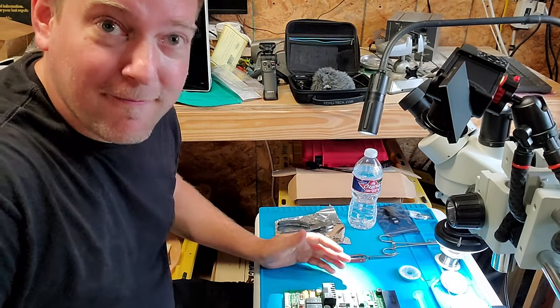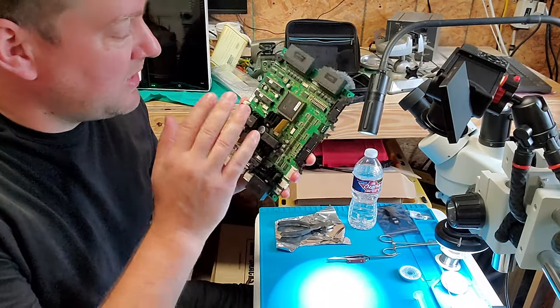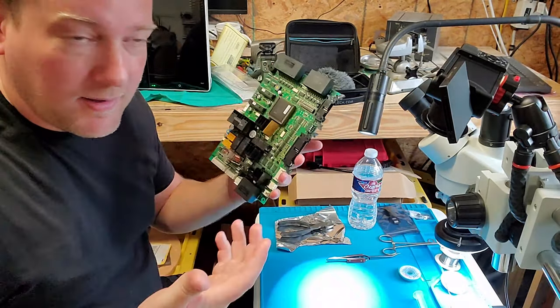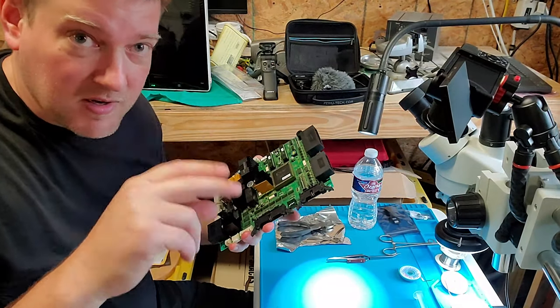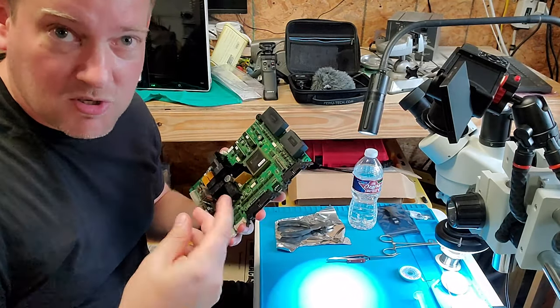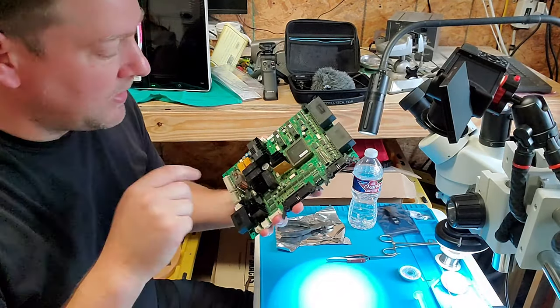Today I have finally received all the parts necessary to fix my board. This is the Skytron surgical table relay board to which the fuse is popped. I went over that in another video because the remote had some yanked cables which then had some conductors touching. The board pops a microfuse as a natural precaution to shut down parts of the table so that you can't inadvertently activate something that you don't intend to.